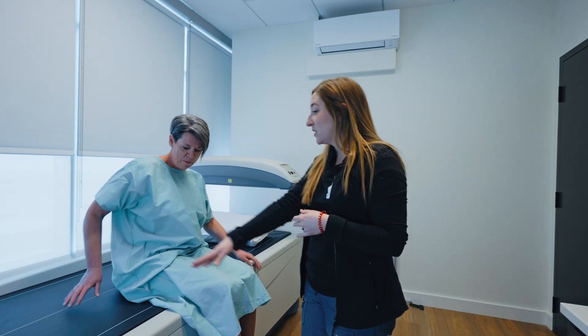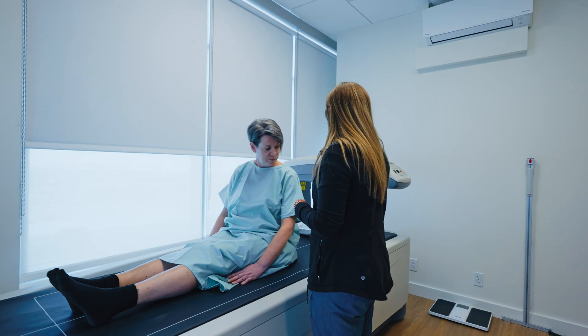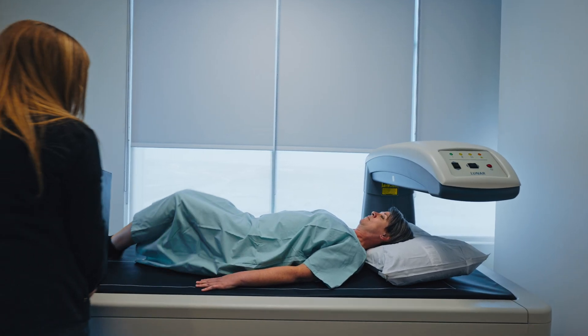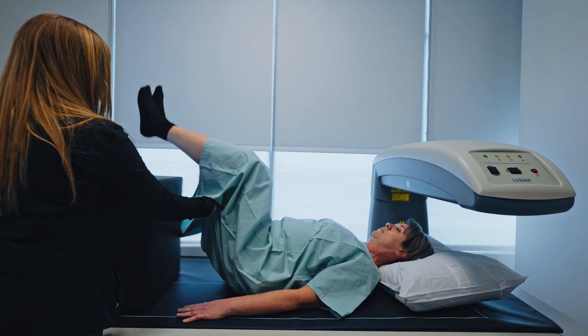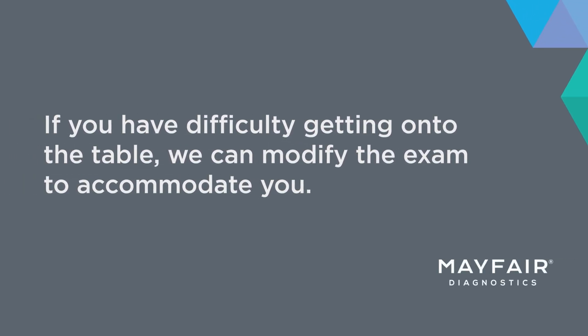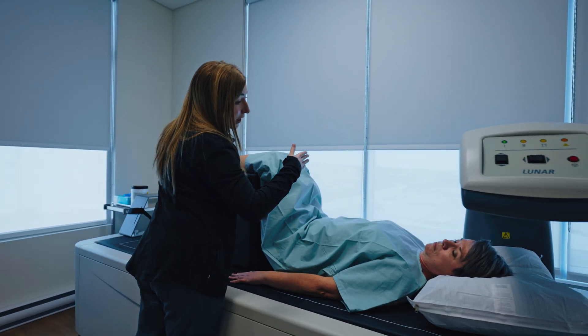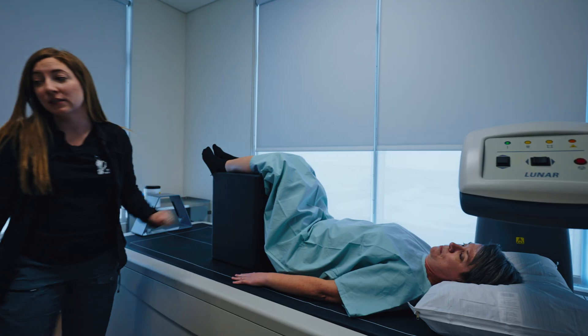Alright, so I'll get you to swing your legs up this way. Center yourself on that white line in the middle of the table there. Good. And you can lay flat down on your back there. Great. Lift your legs up, feet in the air. I'm going to start the machine — it's going to come this way and then it's going to start scanning upwards, okay? So just hold nice and still.